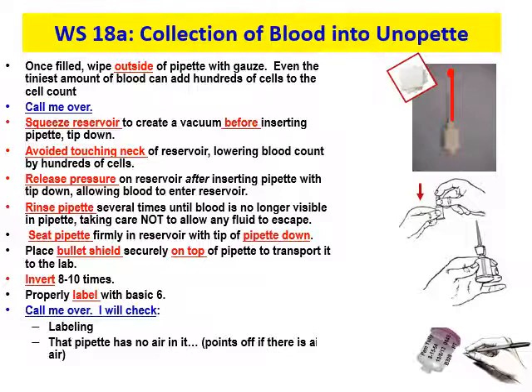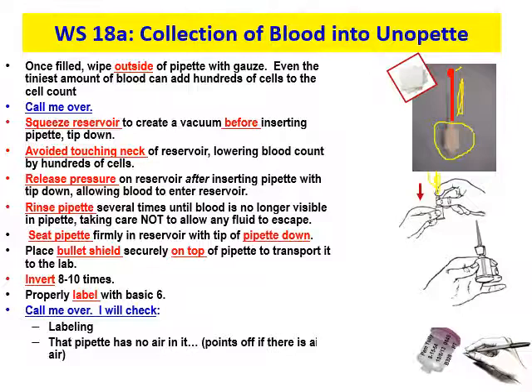Squeeze the reservoir to create a vacuum before inserting the pipette tip-down. Put your finger over the other end, just like we talked about with a straw. With the outside wiped clean and no bubbles, turn it over, squeeze the reservoir in, and put it down into the reservoir — avoiding touching the neck. Once it's down in there, release both your finger on the outside and your fingers on the side of the reservoir, and it will suck the blood from the capillary down into the diluent.